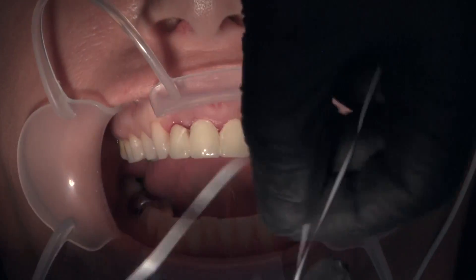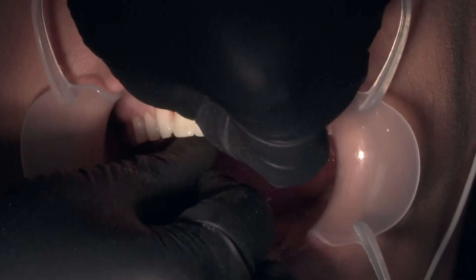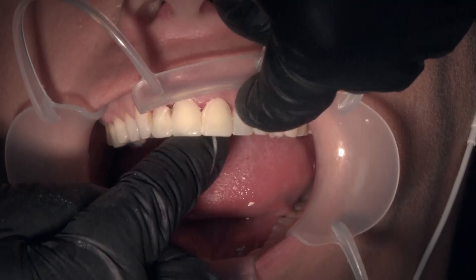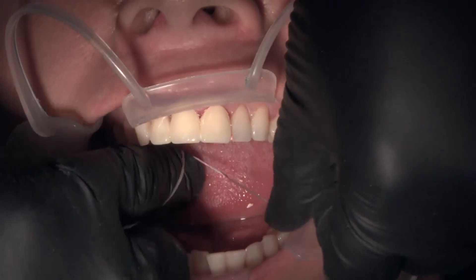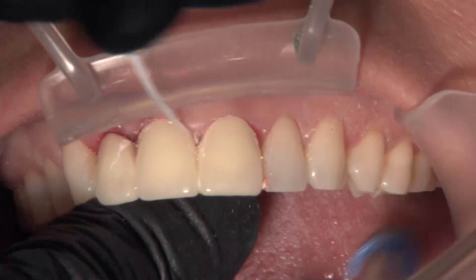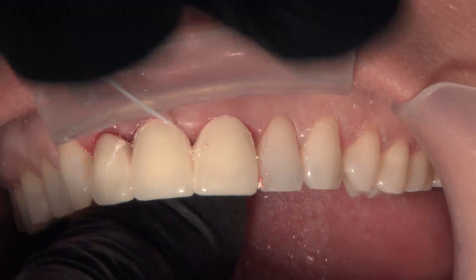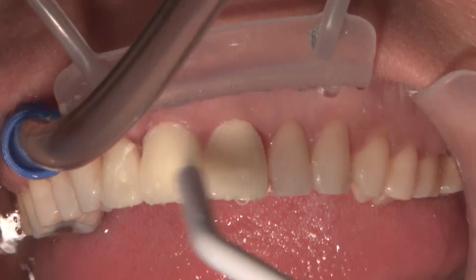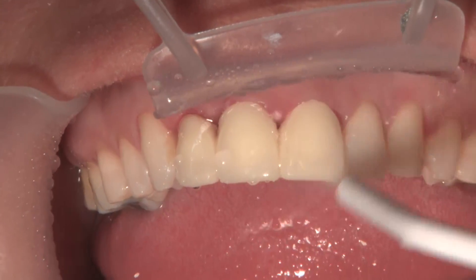With regular Luxatemp Ultra, once you put it into the biotemps and seat it on the preps, it goes from unset to set very quickly. If you have any undercuts or your preps don't completely draw with each other, you can lock that biotemps bridge in place with a bisacryl material. The Luxatemp Solar lets you move it — pump it up and down — and be able to remove it from preps that don't draw. Then you can light-cure it to make sure it's fully set. We'll put that on with some temp bond and clean up the temporary cement.